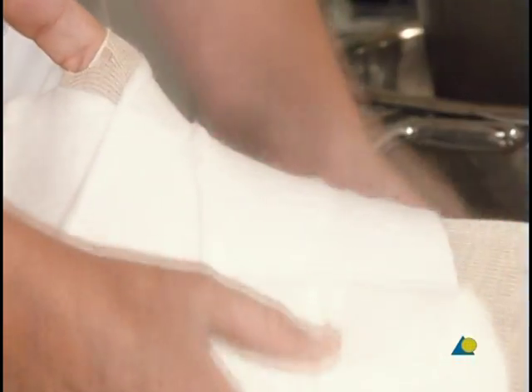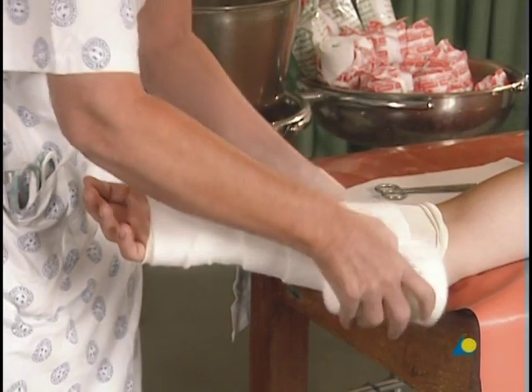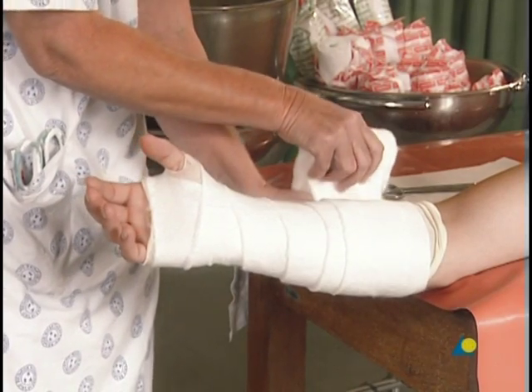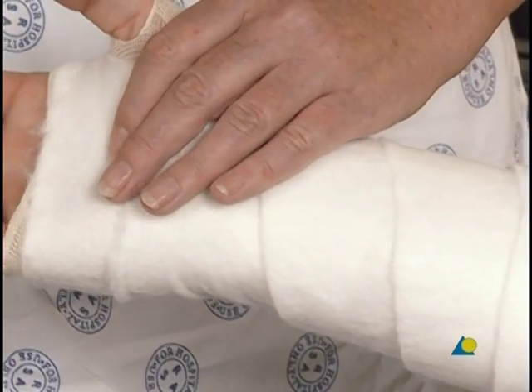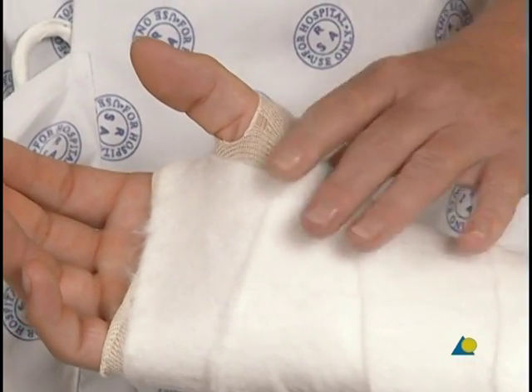The overlap creates a double layer of padding, which is sufficient for most injuries. It should be kept in mind that the more padding that is applied, the less rigid the support to the injury site. Consequently, more than two layers of padding are not normally recommended.